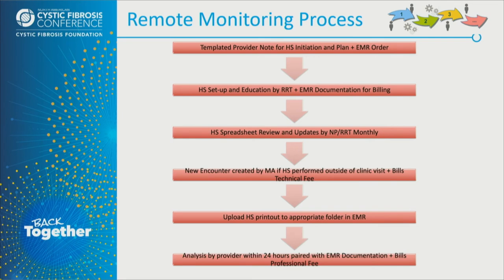And we have this in our MS Teams. So we created a team simply for home spirometry. So now all the providers, the RT, the nurse, everyone can see it, including the MA. And then everyone knows who owns what.